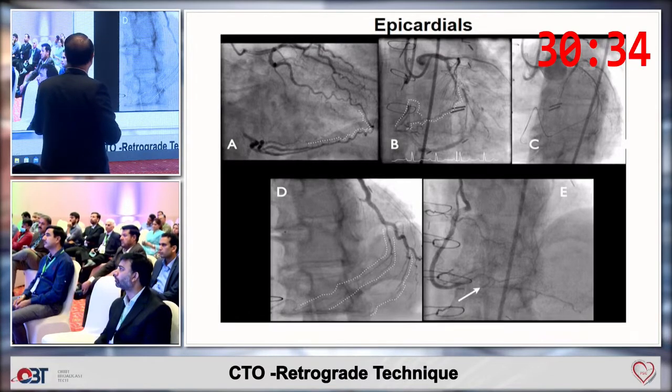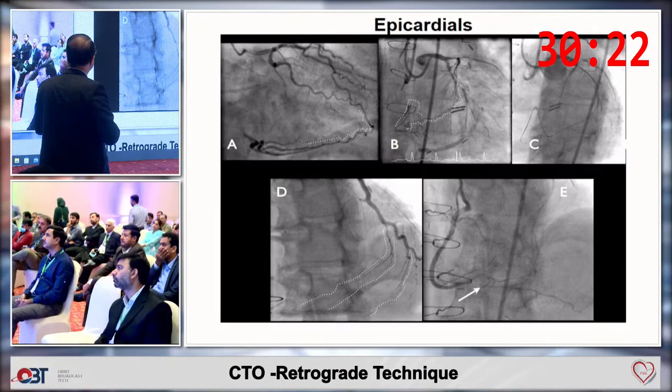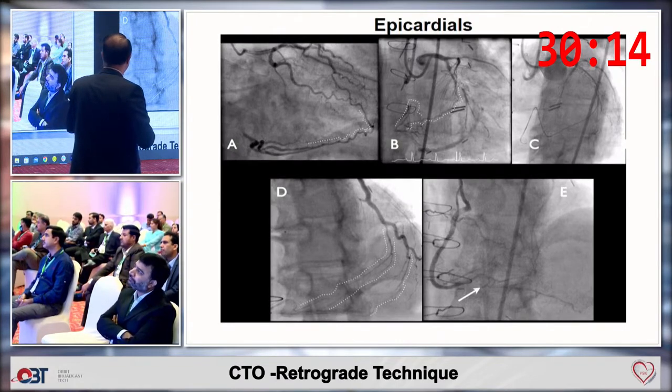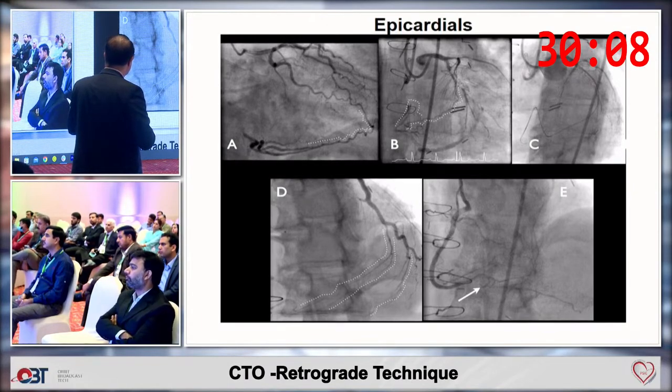So the epicardial collaterals, here you can see this is the OM branch, which is almost connecting directly to the right coronary artery. And these are collaterals in the AV groove. So this is an AV circ, which is connecting to the right coronary artery. And again, these are small collaterals which are connecting, and here we can see some.